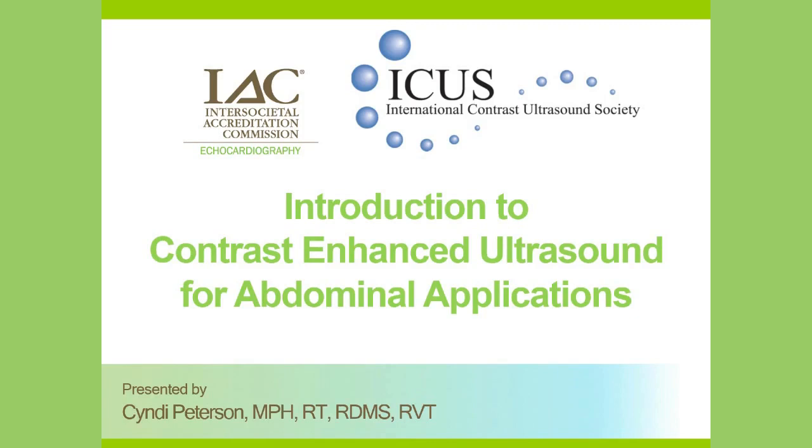Ultrasound contrast agents were approved in the United States in the early 21st century for evaluation of cardiac ultrasound, in particular to opacify the left ventricular border. However, radiology applications were not approved in the U.S. until the year 2016. In Canada, Europe, and Asia, the approval for radiology applications, and in particular the abdomen, came around the same time the United States had cardiology approval. Therefore, we are slightly behind the curve in the United States. However, we are catching up rapidly.